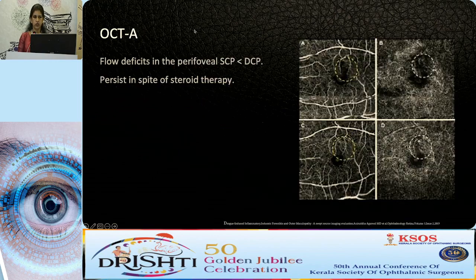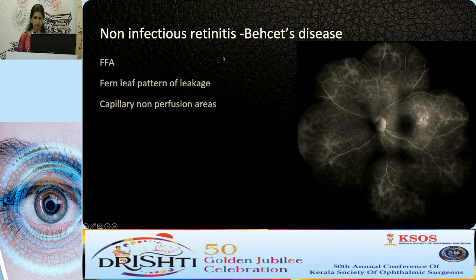The OCT angiography again shows perifoveal flow deficits, more in the deep capillary plexus than the superficial, which persists in spite of steroid therapy.